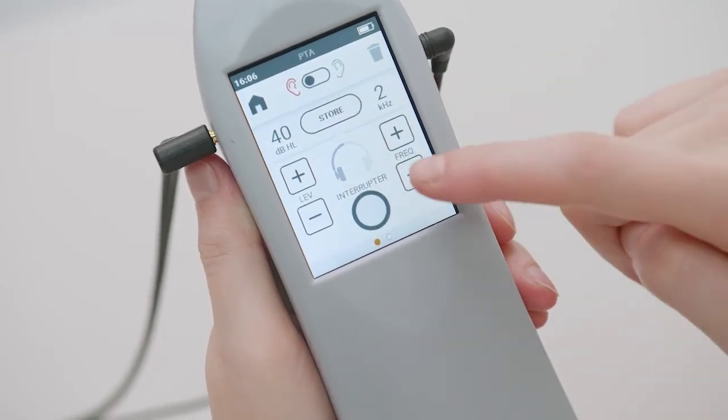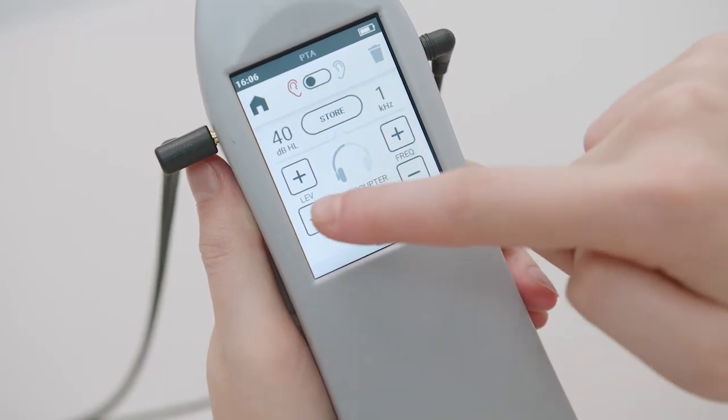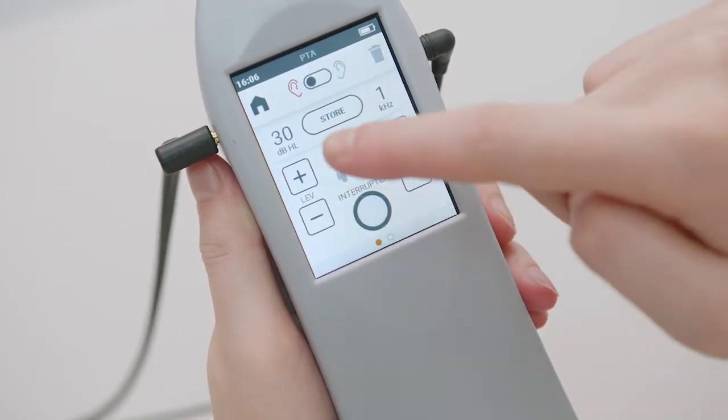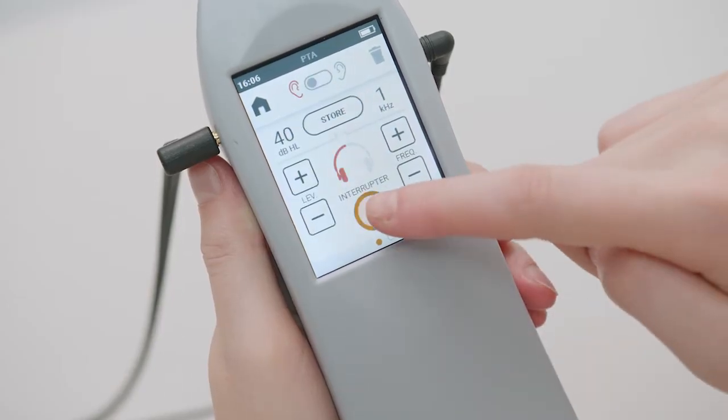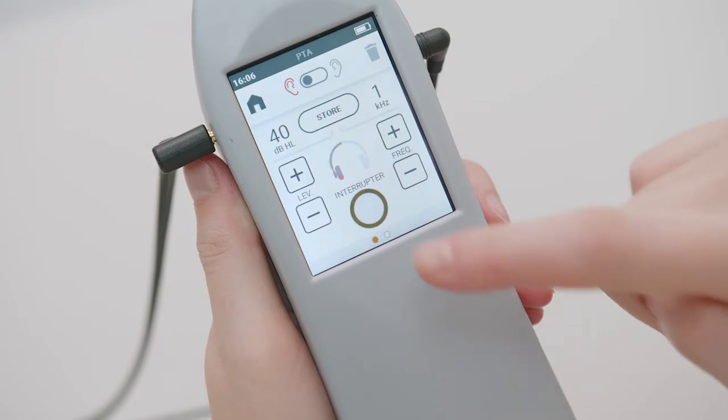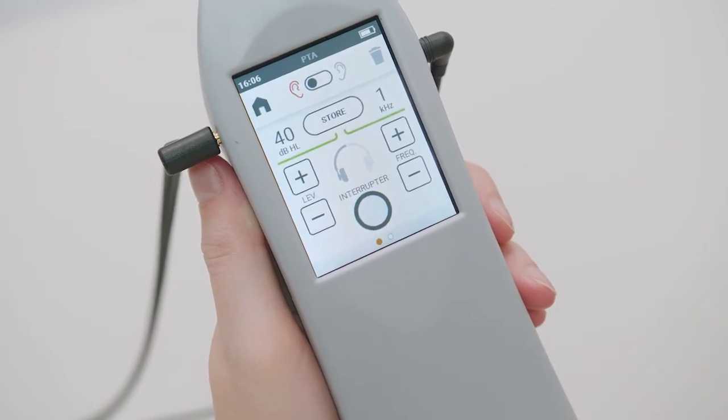The user can select the frequency and intensity of the stimulus using the plus and minus keys on the device and send the stimulus to the patient using the interrupter button. The green indicators are activated upon the patient's response and signify when the stimulus is heard.